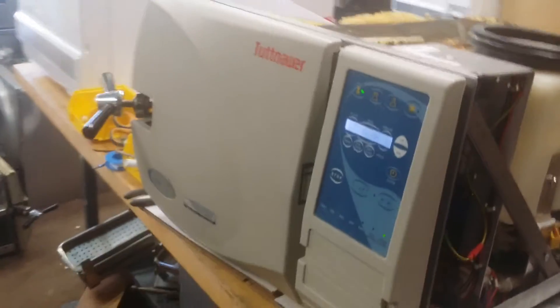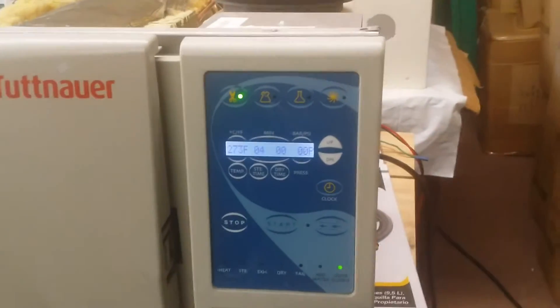On the front side is the control panel. This control panel looks very good, like new. The left side has a circuit board, and underneath you can see the water pump and the air pump. This is for the dry cycle.